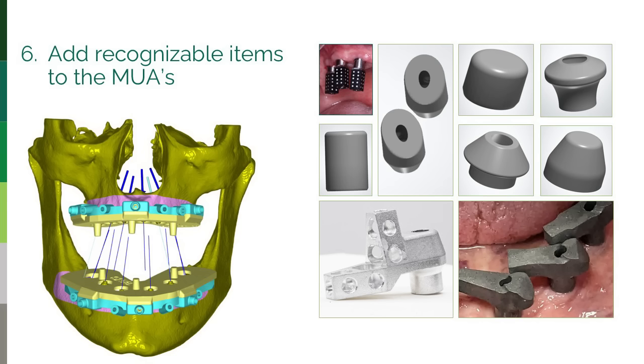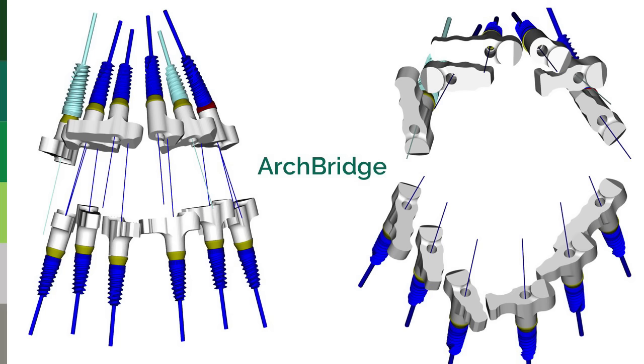These days we don't really need a sutured scan with the healing collars, because we know where your bone is reduced. We guided it, we planned it, we know where the bone is, and we just build in that gap. So we keep it real simple. And while you're suturing, your team has already uploaded the files to us, and we are fabricating.